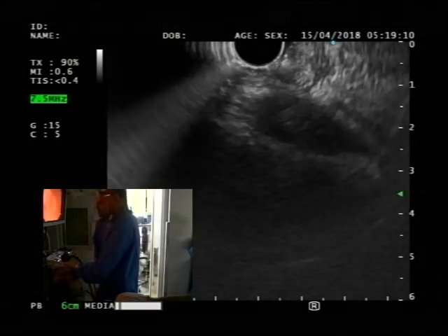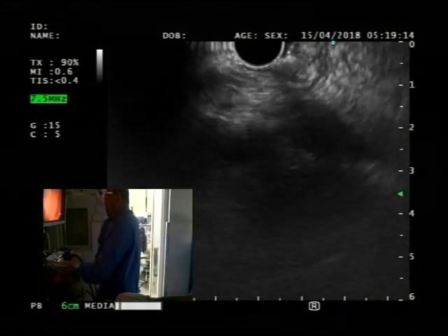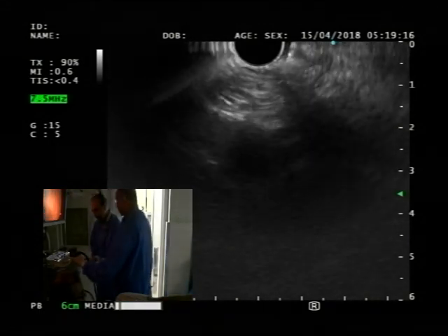So they're evaluating it still, but it may not be the perfect pass. So we'll get another one. Yes. Thank you.